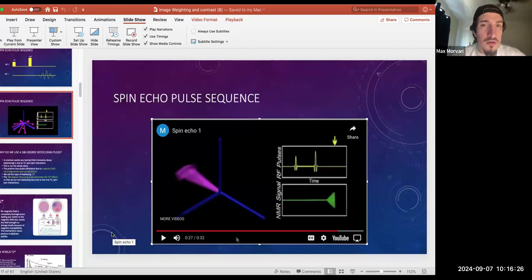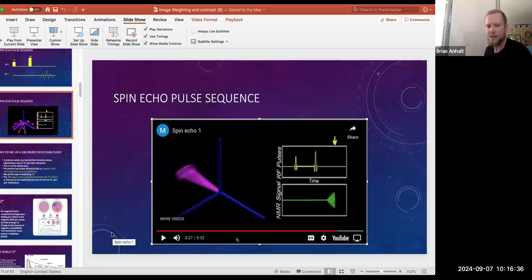So pretty much the refocusing pulse is just to recycle the signal, right? As they flip it over. It's to get the signal back, to eliminate dephasing effects due to inhomogeneities and susceptibilities. It's to get that signal back. Because the signal that comes back is actually a little bit less than it was at the beginning, because true T2 interactions are still happening.